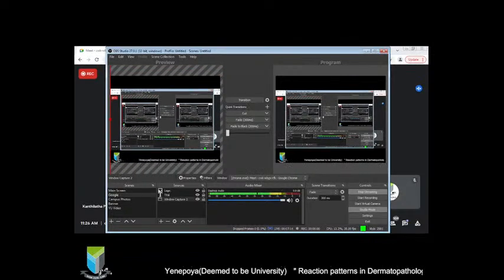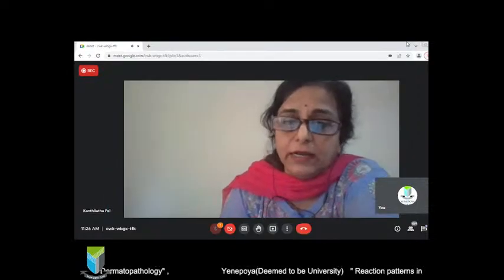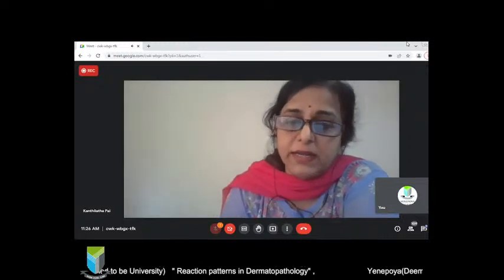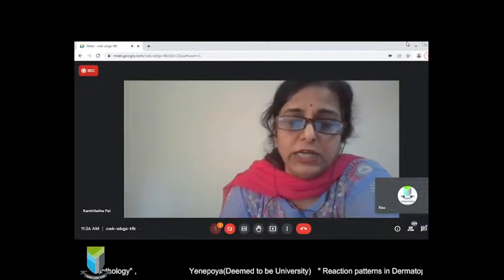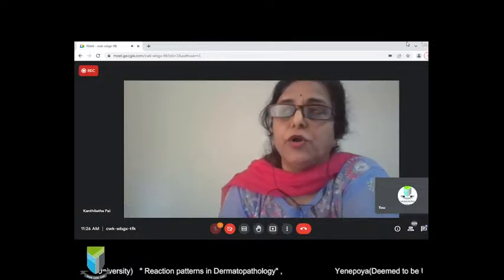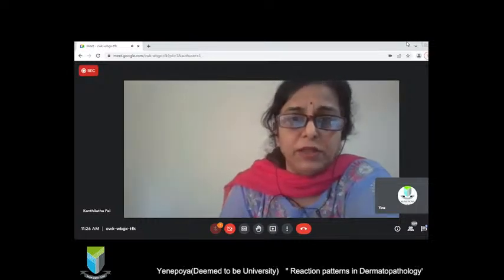So the distribution of the infiltrate, as I told you, the location of the infiltrate, the nature of the infiltrate, and finally clinical correlation. Never ever make a diagnosis of chronic non-specific dermatitis. This is not something that we report in dermatopathology, unlike inflammation in other organs. We do not call it chronic non-specific dermatitis. It is not to be used in dermatopathology.